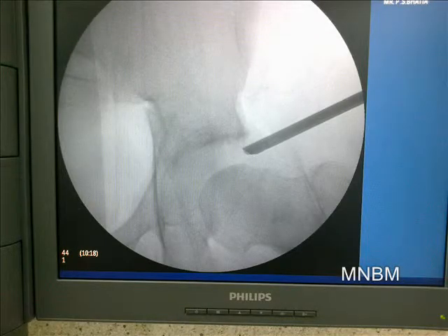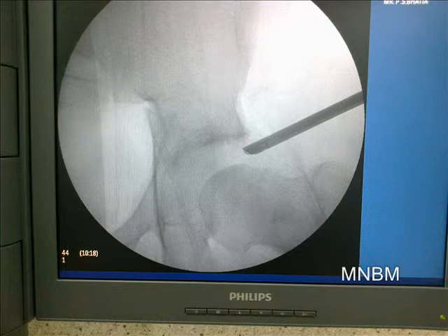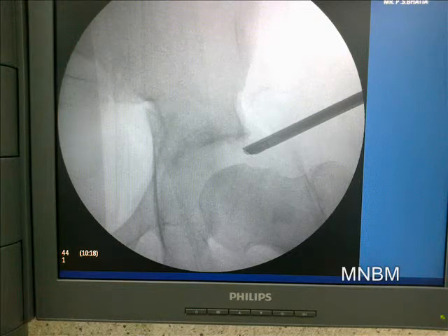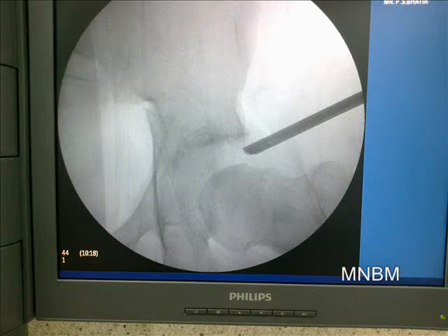After achieving adequate debridement, we re-visualize under the image intensifier to see whether we have taken off enough osteophyte and bone to allow for smooth gliding of the hip joint.